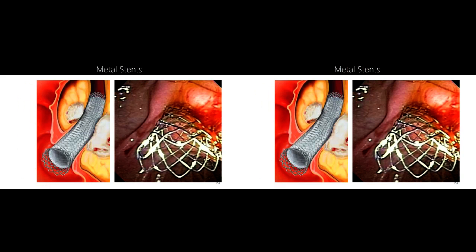Last concept of the day, the metal stent. Here goes. Stents 101. Step 1, imagine you have got some wire in a grid. Simple. Step 2, fold that wire so it's in the form of a tube.